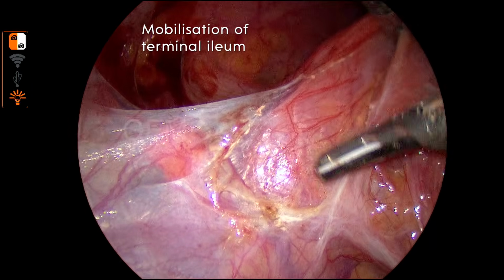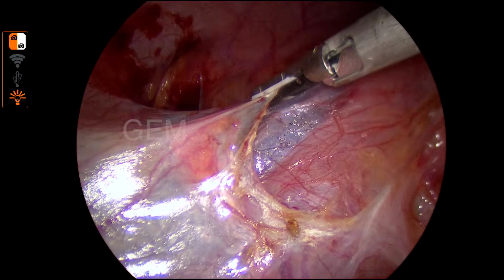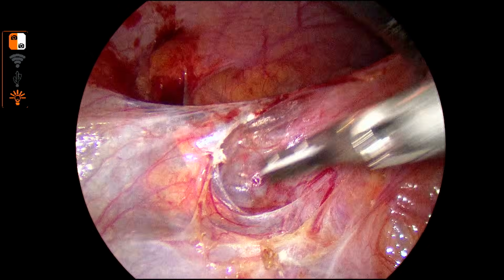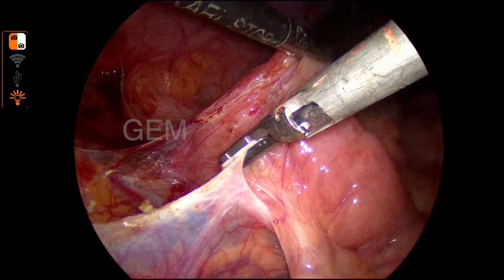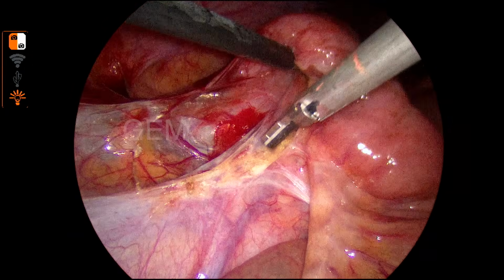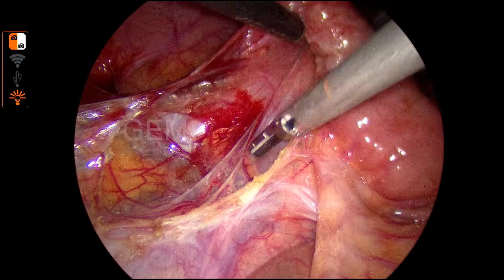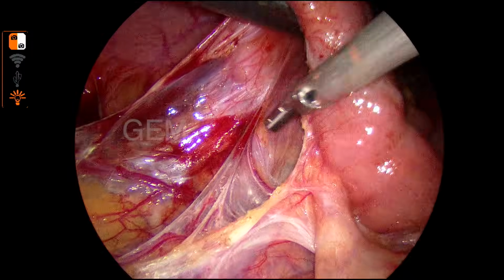Now you can see I open the peritoneum, and I am pushing up the ileum. It's very easy. Once the peritoneum is open, you can see dissection is very less, even that fat bleeding to be coagulated. So I'm coming up to the root of mesentery, my left hand is lifting the ileum, and with the harmonic I am pushing down the retroperitoneal structure.